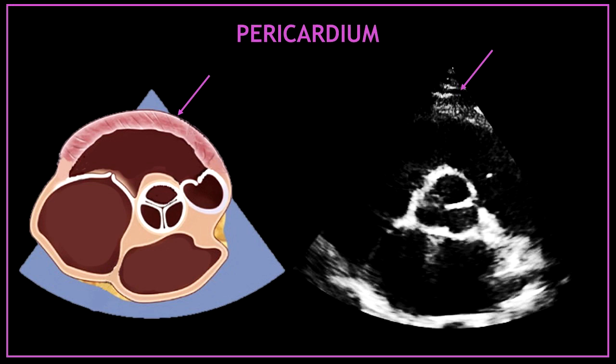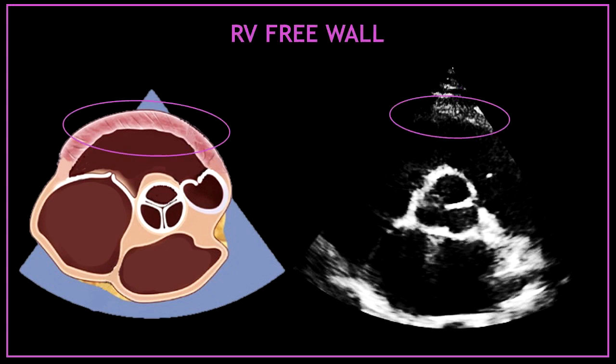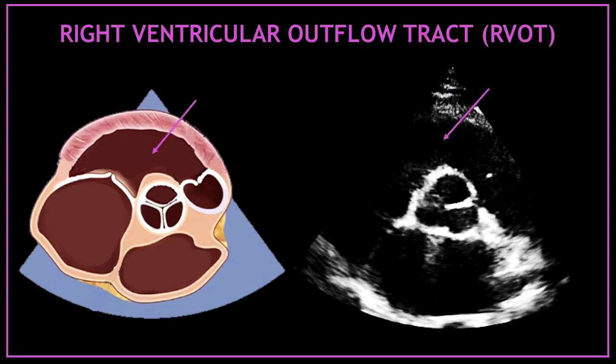Next to the pericardium we have a less bright and thicker segment that corresponds to the right ventricular free wall. The most anterior black space or echo-free space is the right ventricular outflow tract.